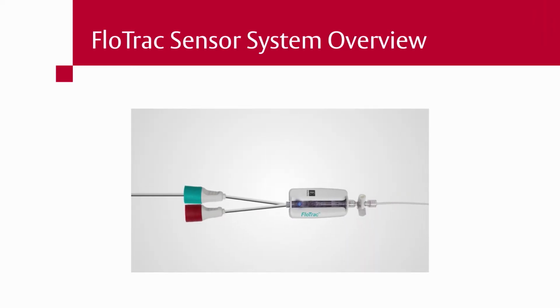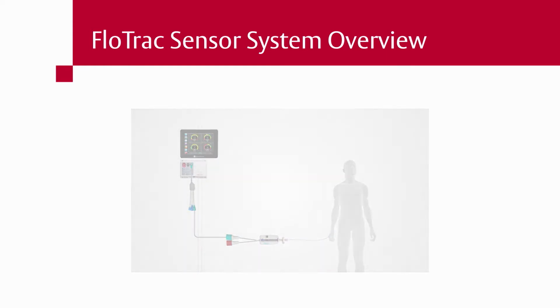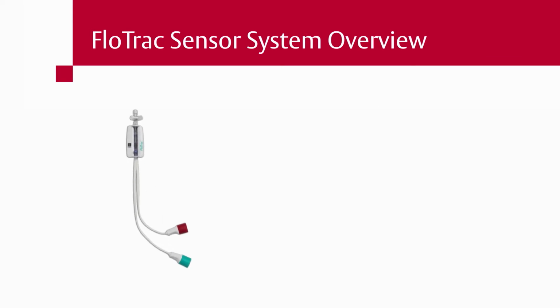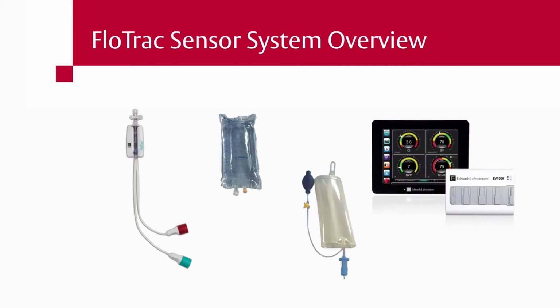Proper setup of the FloTrac sensor for use with the EV1000 clinical platform requires the following components: FloTrac sensor with or without VAMP system, radial or femoral artery catheter, arm board with radial arterial catheter, sodium chloride flush solution bag, 500 or 1000 milliliter, pressure infuser bag appropriate for flush bag being used, EV1000 clinical platform and components including Ethernet cable, bifurcated power cable, and mounting solution, a trifurcated pressure cable. Please refer to institutional practice for catheter dressing and heparin use.